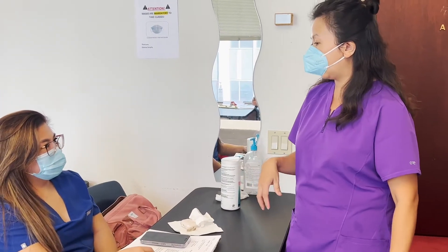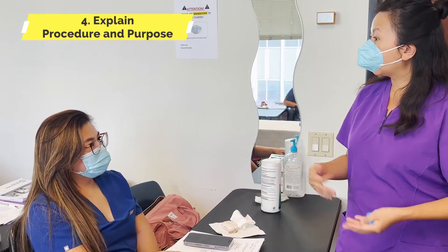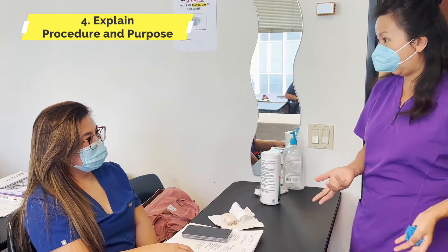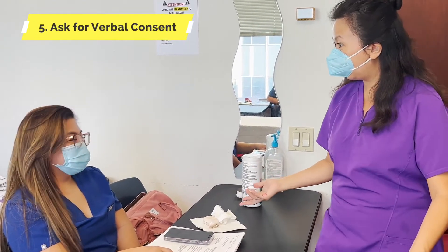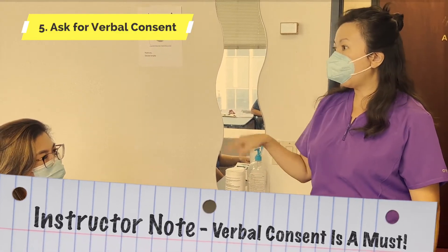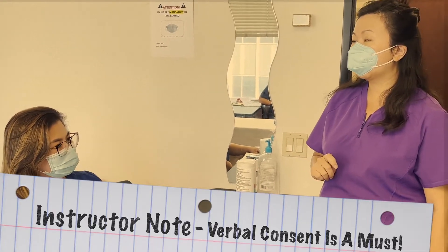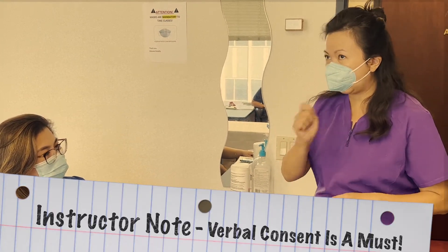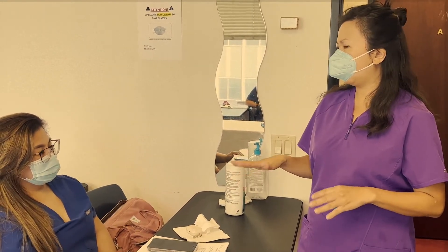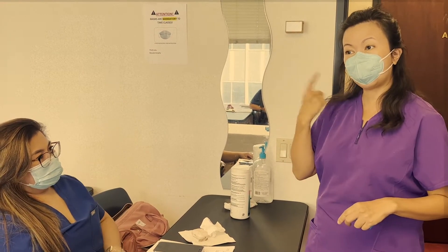Okay, so if that changes, let us know. As you know, you're going for surgery. And so what I'm going to do — because there's an order for blood draw and IV — is that okay with you? Of course. On an instructor note: if they're already admitted in the hospital, they already signed the consent. So there are certain procedures that really need actual written consent. But for IV and blood draw, it needs to be verbal. So I need to hear that from you guys.